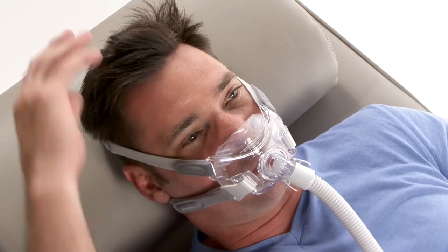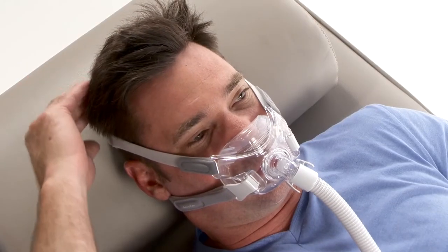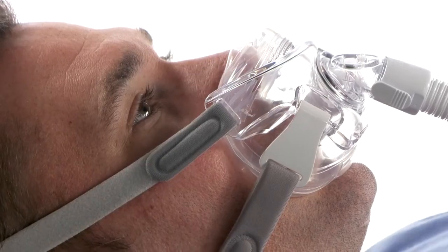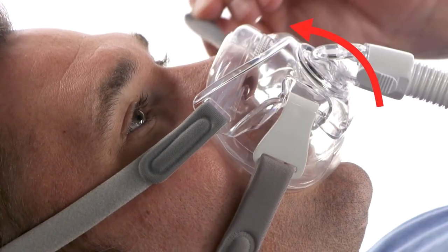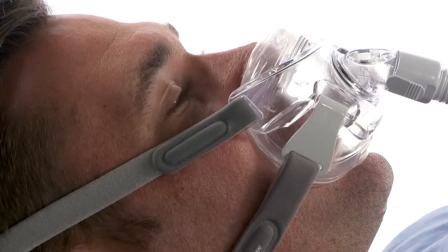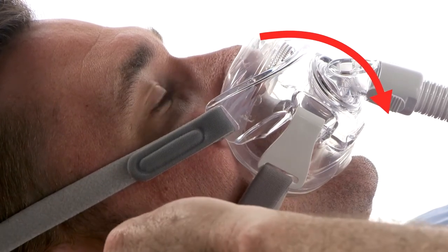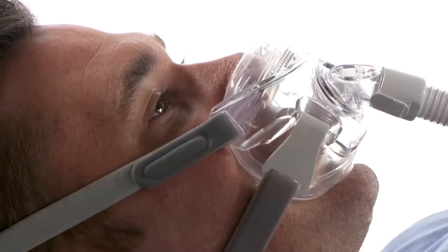For comfort, adjust the crown headgear strap to lift the straps off of your ears. For leaks around your nose, adjust the top headgear straps to tilt the mask slightly upward. If air is leaking around the mouth or chin, adjust the bottom headgear straps to tilt the mask slightly downward.